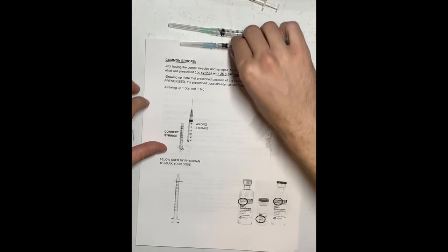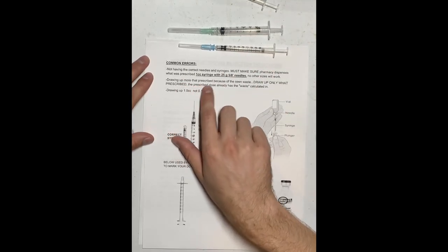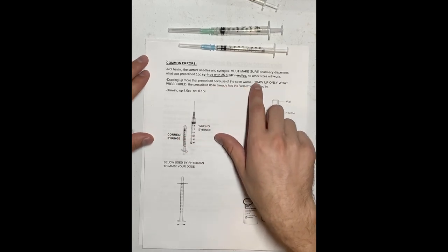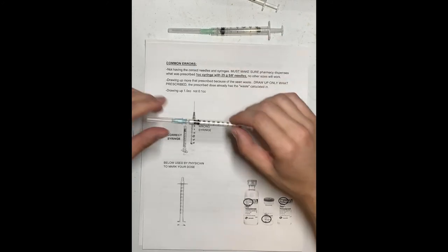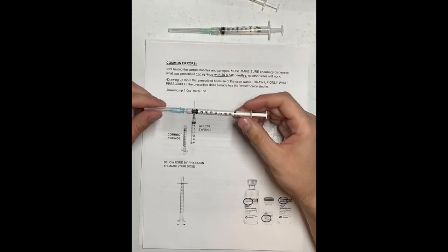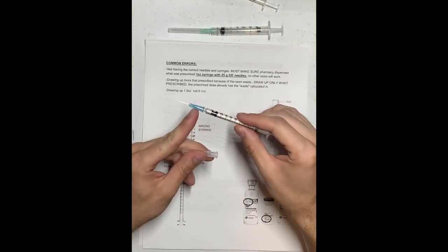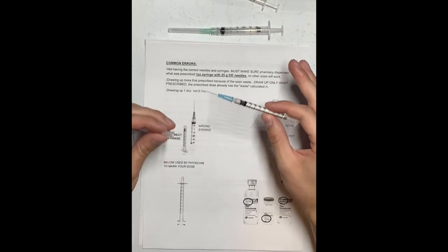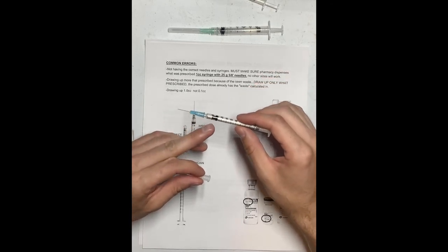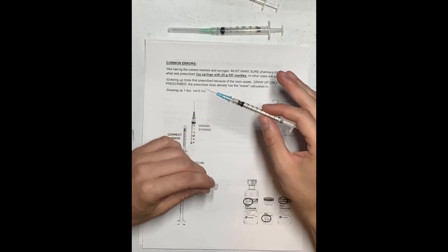Number two: drawing up more than prescribed because of visible waste. When you are drawing, just draw to your prescribed dose — for example, 0.1. You might see some fluid remaining in the needle; that is normal and is accounted for in the dose your doctor gave you. Just draw to 0.1 and don't draw up more than that.